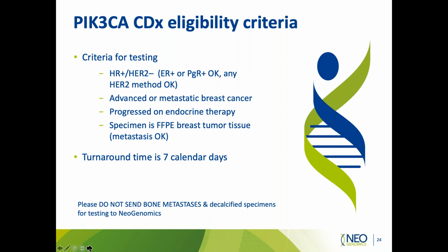The turnaround time is about 7 calendar days. We need formalin fixation. That's the FF in FFPE. Zinc fixatives will not do. And unfortunately, decalcified specimens will also not do. But soft tissue metastases will do fine for testing. Next.